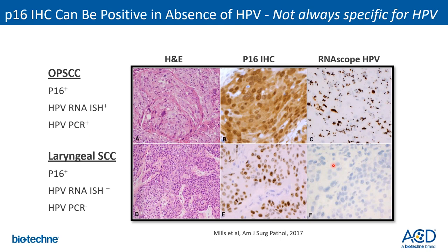This is an example of a head and neck tumor showing P16 positivity in the absence of HPV. The top panel shows a laryngeal squamous cell carcinoma where RNAscope for HPV is strongly positive, as is P16-IHC. However, the bottom panel shows a laryngeal squamous cell carcinoma with completely negative staining for HPV by RNAscope — yet strong P16-IHC signal. PCR analysis confirmed this case was negative for HPV — a perfect example of a false positive where P16-IHC was activated by a pathway independent of HPV.